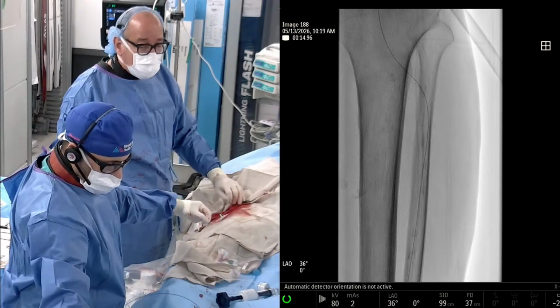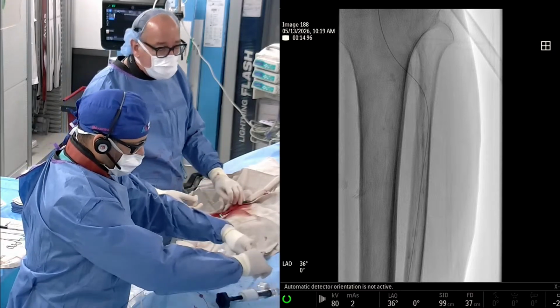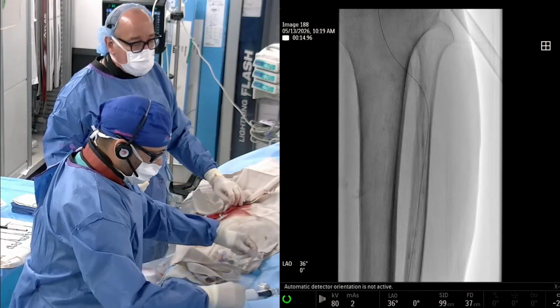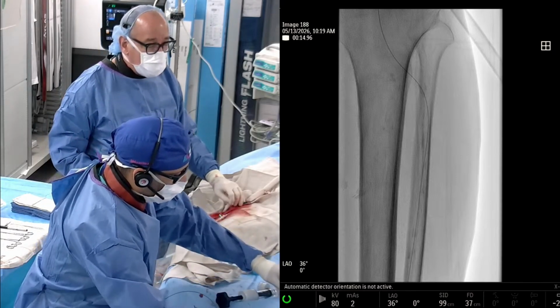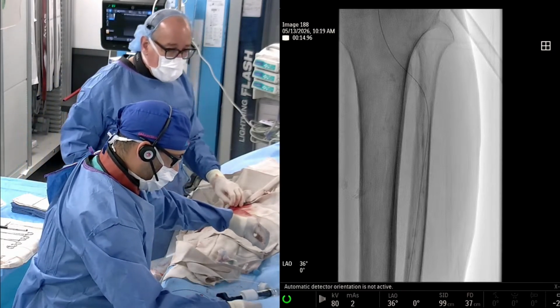And then the question comes up, which I think is a reasonable question, Joji, and I'm really interested to hear your perspective on this: in this setting when this patient basically has 2 vessel runoff, there's a peroneal, which looks like it continues into the PT, and the anterior tibial, for just rest pain without tissue loss, do you do a single vessel revascularization or a 2 vessel revascularization?